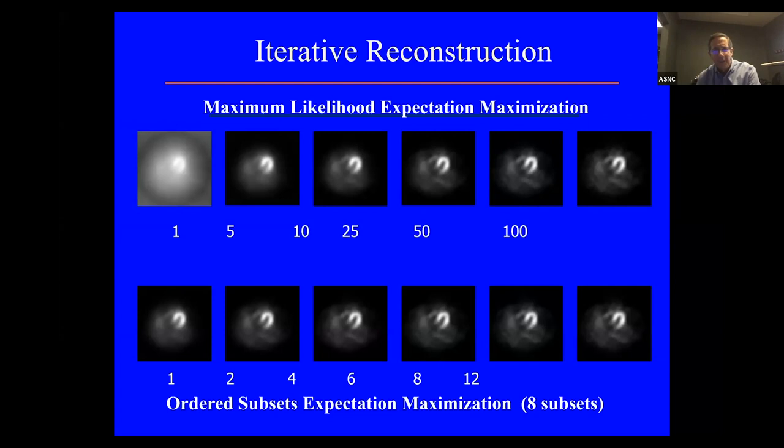And every few minutes, it cuts back to this computer screen with these lines coming down, and you're seeing a little better picture. And finally, at the end, it shows a picture of the culprit. And that is iterative reconstruction.